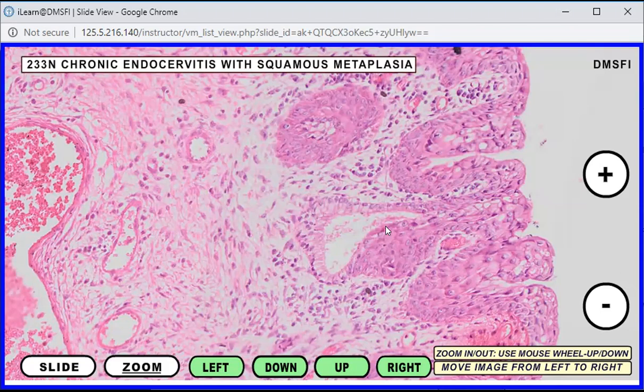Another perfect example of metaplasia would occur in the esophagus. This is different because the lining epithelium of the esophagus is squamous epithelium, but it becomes columnar. That is an example of Barrett's esophagus.